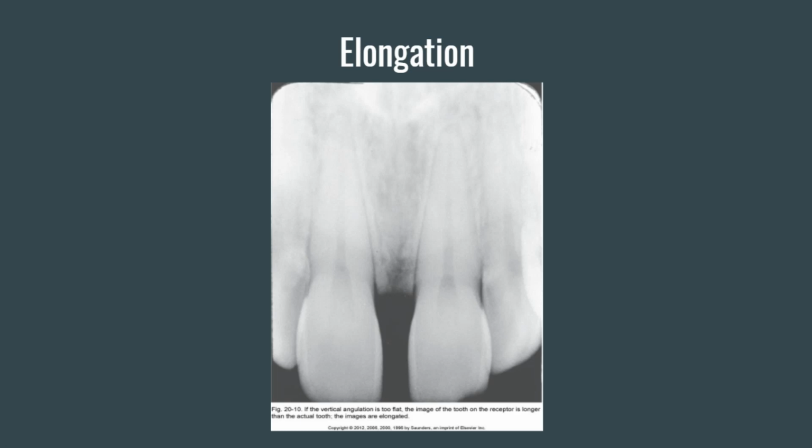And then elongation is the last angulation error. This is also our vertical angulation. In this case, the teeth appear long and distorted, and this is from not enough or insufficient vertical angulation. So our angulation was flat.